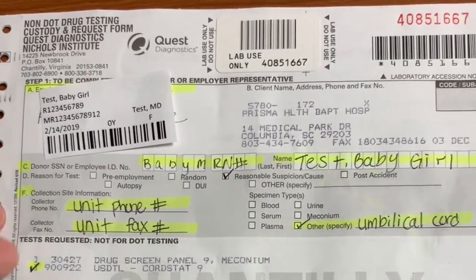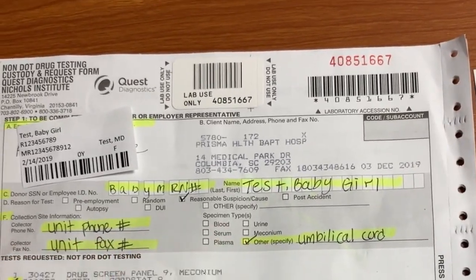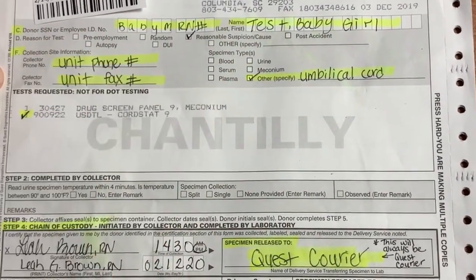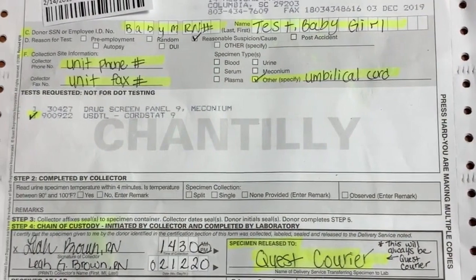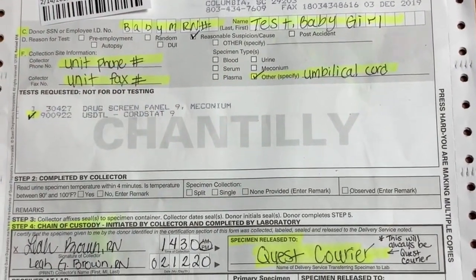Then you will check which section. If this form is filled out for meconium, you would not select other, you would check meconium and then select whichever one applies. Step 2 is not filled out because that is for urine only.